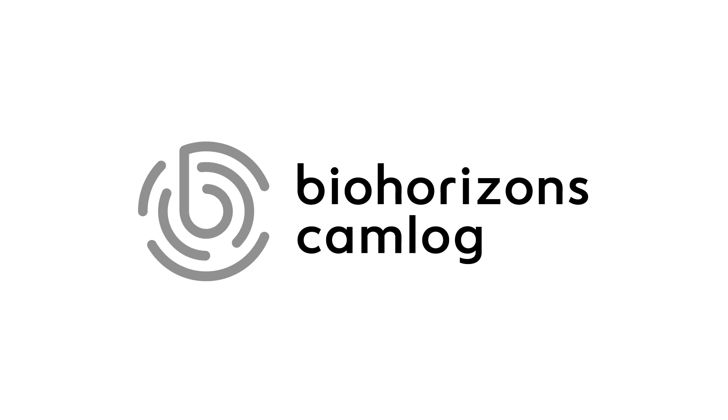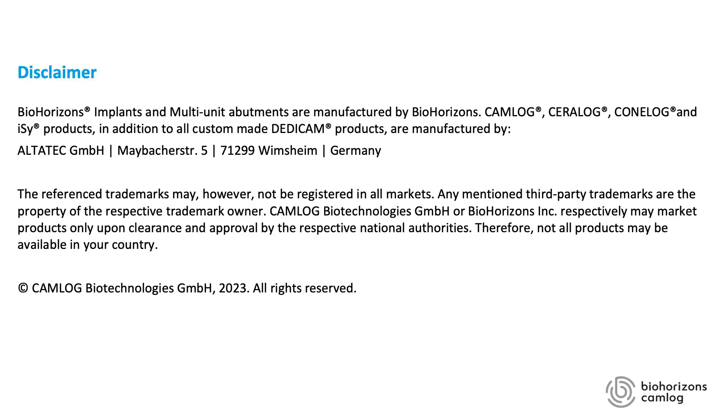After surgery we allow healing of about 5 to 7 days and then we remove the stitches. To summarize: this surgical approach gives you the opportunity to gain keratinized mucosa, to combine implant placement and uncovering procedure, and finally you have easy control of gaining height of attached gingiva around your implant. I wish you good success with your next surgery — the transgingival implant placement. Thank you.